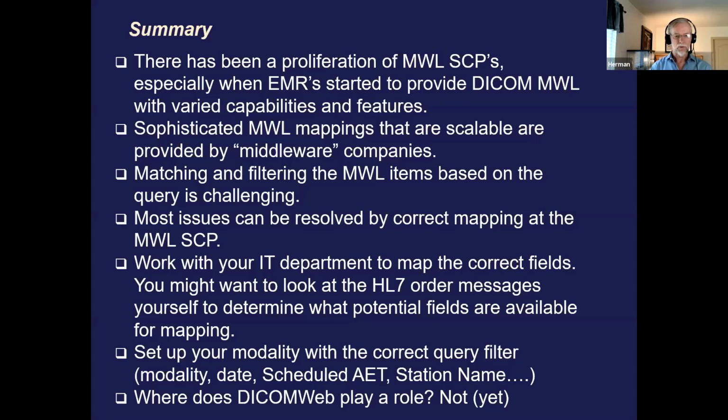So the new DICOM web, I don't think it's going to play a role for the traditional modalities for a really long while. But it might play a role for the point-of-care ultrasounds, all the things that people wear in the pocket that connect to the phone or the tablet, where we want to get these general-purpose worklists.